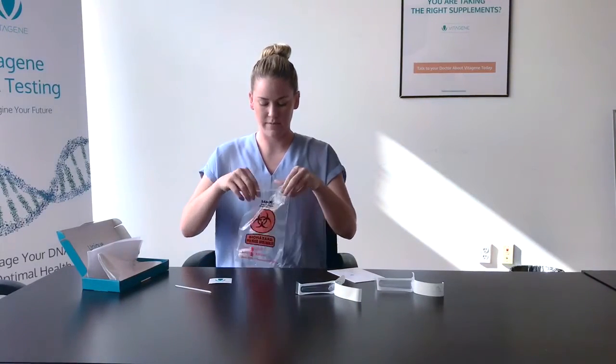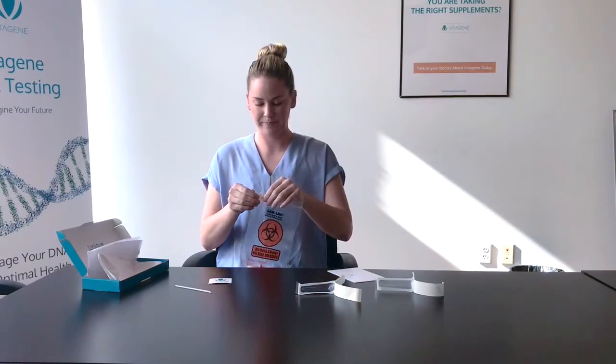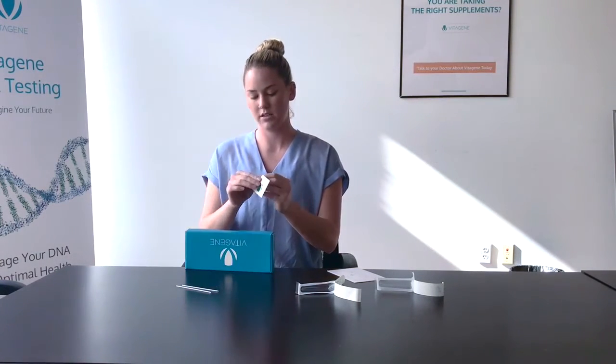Place each vial into the baggie, zip it up, and put it right back into the box you got it in. You can use your VitaGene sticker to seal the box.